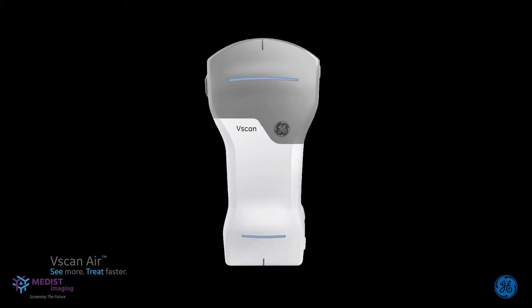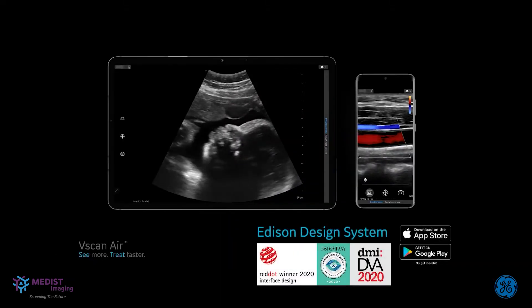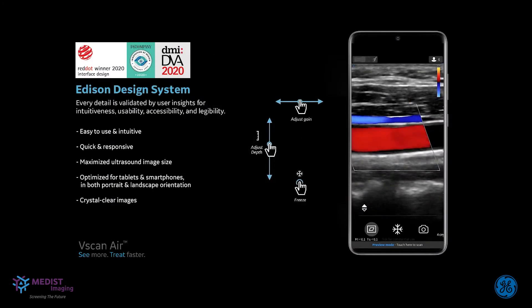Additional workflow-simplifying features on the probe include a physical button that can be personalized to your scanning needs, such as freeze or store, which can be beneficial during procedures. The vScan Air's easy-to-use and intuitive design is not just limited to the probe — it extends to the mobile application as well. GE Healthcare's award-winning Edison design system brings a user-centric and intuitive interface suitable for both smartphones and tablets. The vScan Air app is designed to be predominantly used single-handedly, with features such as the ability to adjust depth and gain with a simple swipe of your thumb.